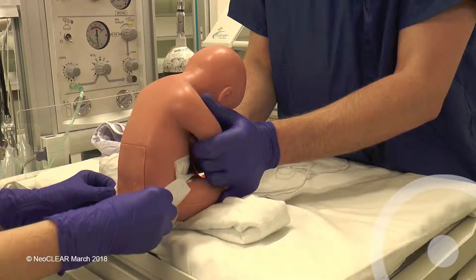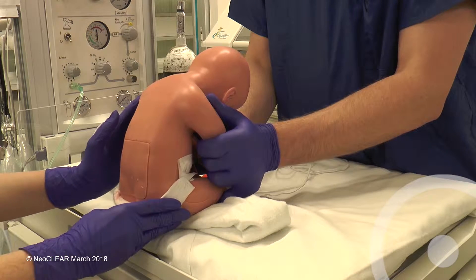Operator and first assistant should be happy with the height of the bed and that the baby can be held correctly. Pull the nappy out of the way.